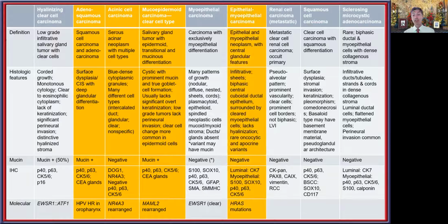So when one thinks about myoepithelial cells as a whole, the actual native myoepithelial cells as they are involved in the salivary gland architecture do not necessarily stain the same way as a neoplastic myoepithelial cell. And so this is why I will often perform 3 or 4 different myoepithelial markers in order to confirm the diagnosis, because you may have a fantastically positive SOX10 and the smooth muscle actin and GFAP will be completely negative. So it is a tumor category where I do tend to do a few more markers.